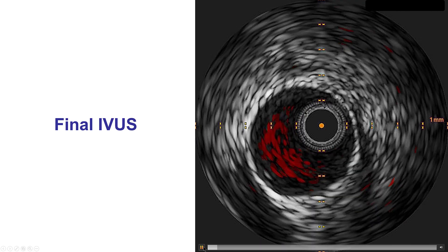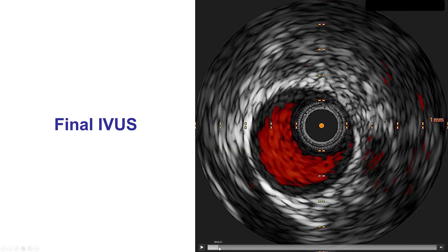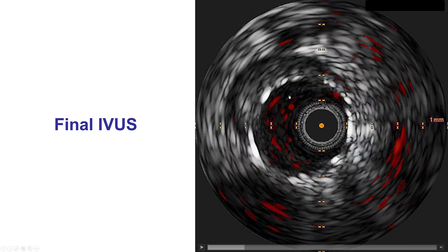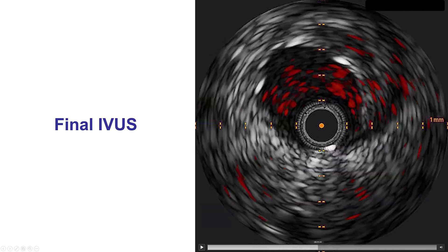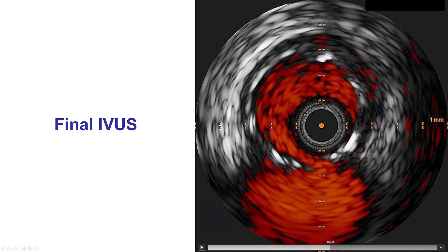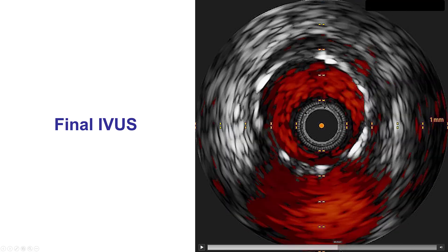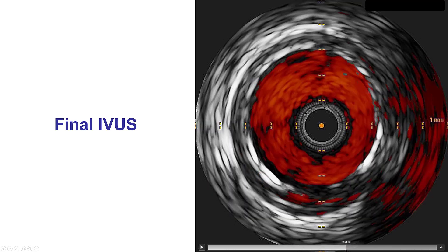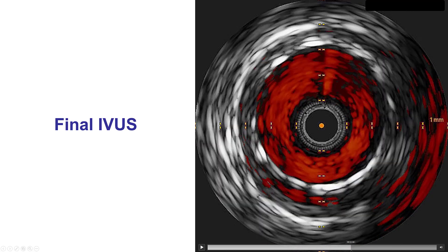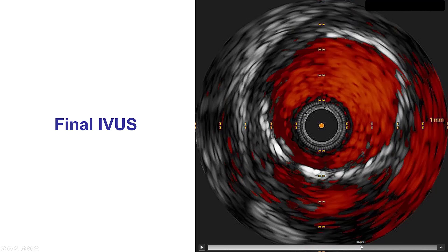This is the final intravascular ultrasound. The stent in the LAD is well expanded as expected because of the soft plaque, and there is good apposition of the stent with the wall. As we come further back towards the takeoff of the circumflex, the left main again is well covered by stent.